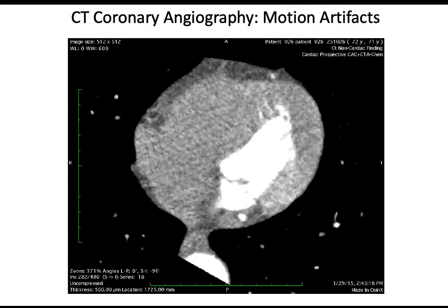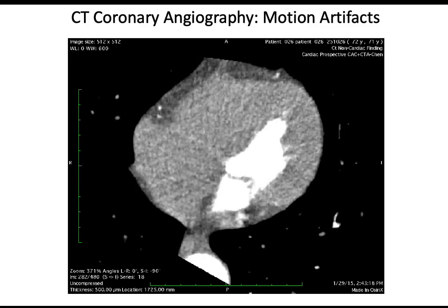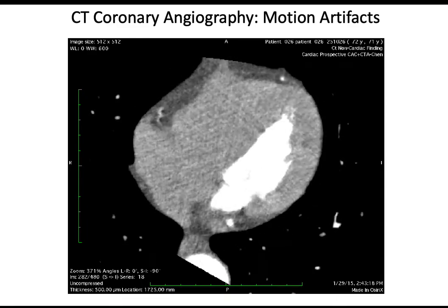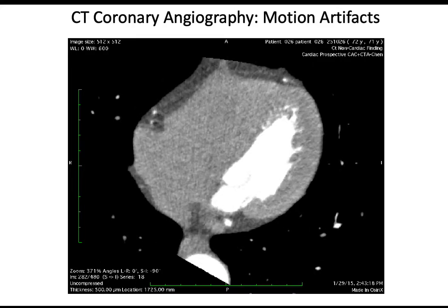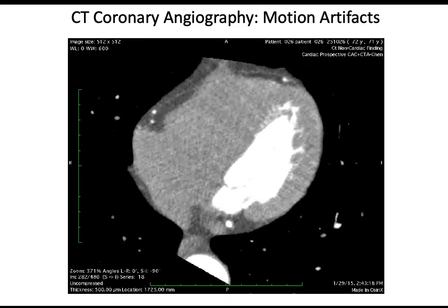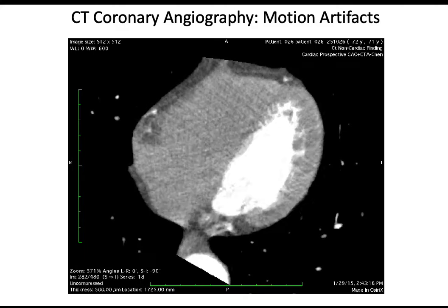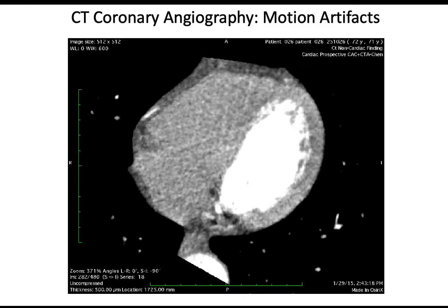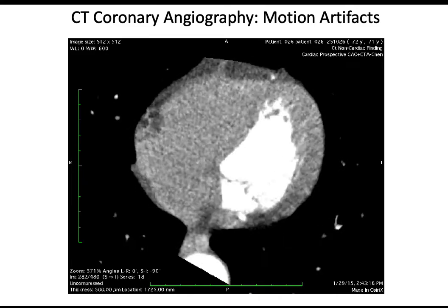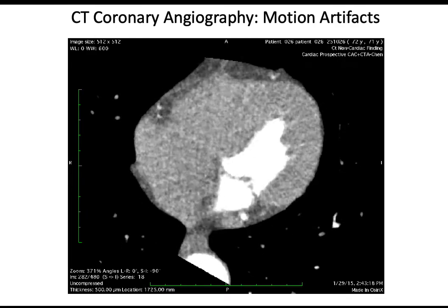So if you were running a CT shot for the heart, what could you do? You can decide, I'm going to scan the whole heartbeat. Instead of getting one picture at the resting, end diastolic phase, I'm going to scan for a second, and then let the radiologist scan through these pictures and pick the one that they like best. In terms of having non-diagnostic scans, that would decrease that risk. But what would you be doing? What's the price?